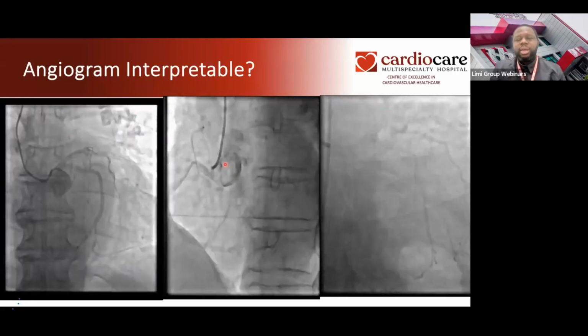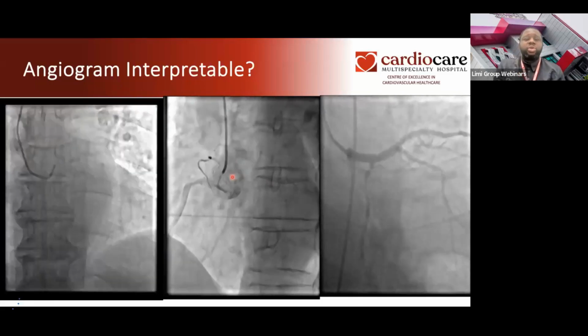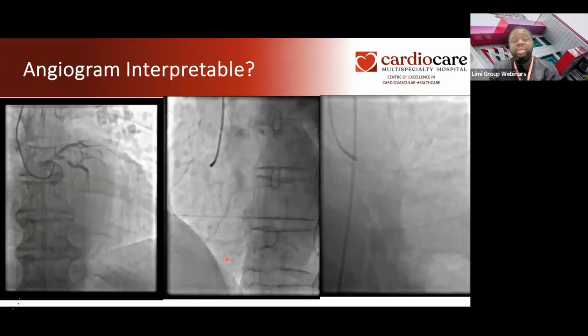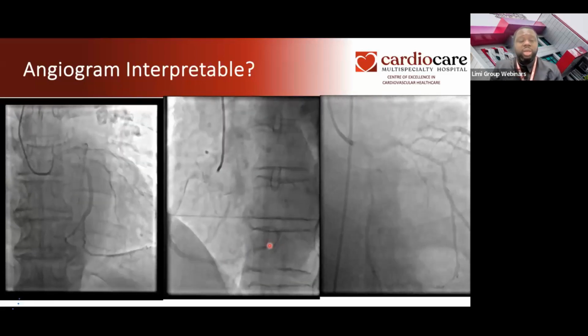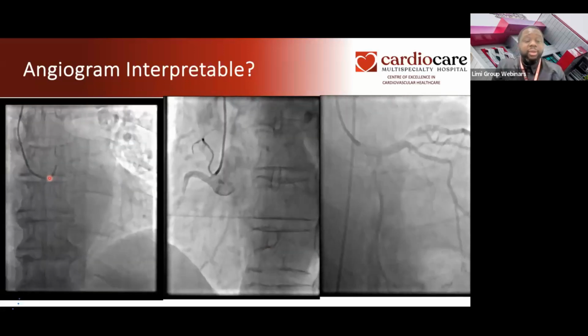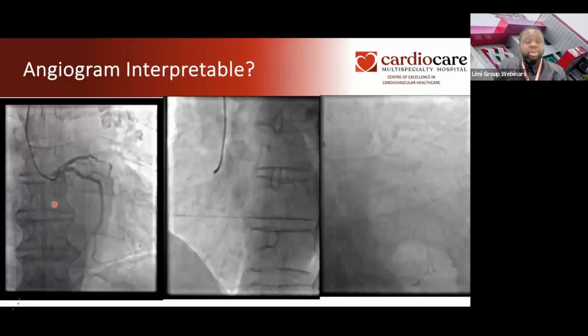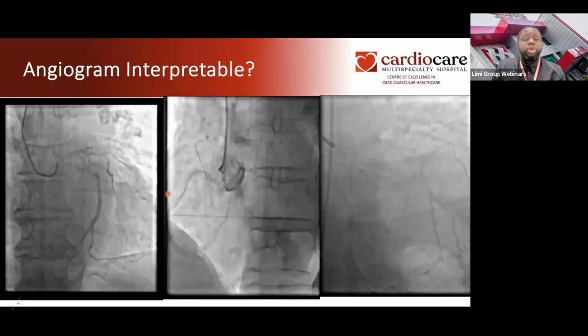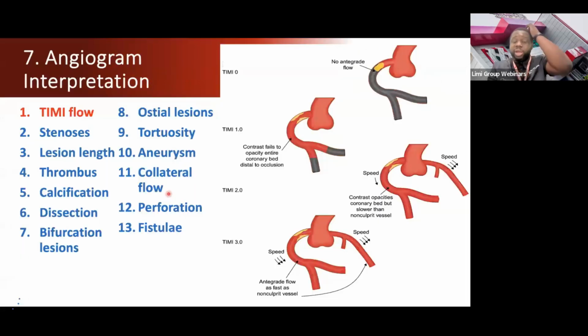The catheter came out while they were about to shoot it and did not opacify. So you are not sure 100% whether there's an obstruction there or not. This one is a deadly one. It's even shooting up at the top of the vessel and came out. Only a small amount went in, so it's not well opacified. That's one of the first questions you need to ask yourself.